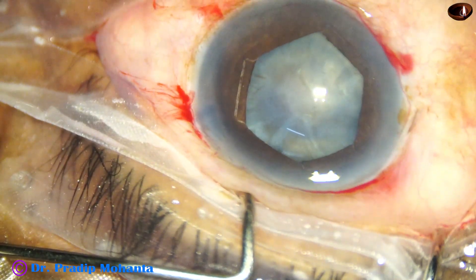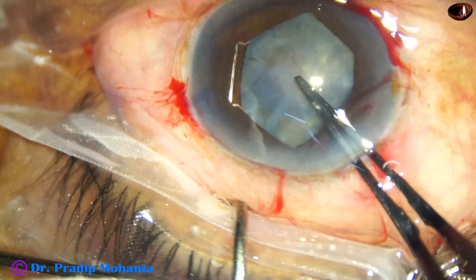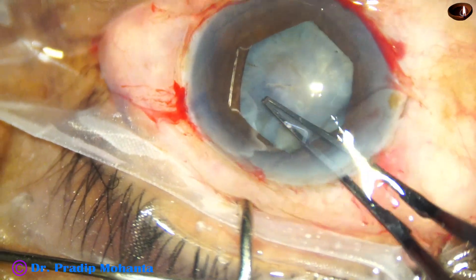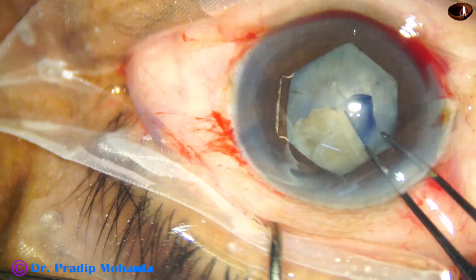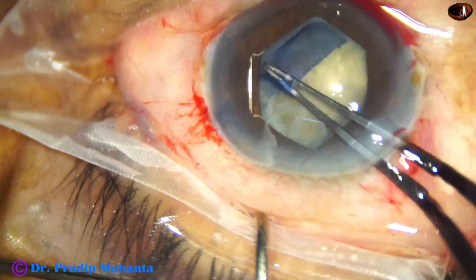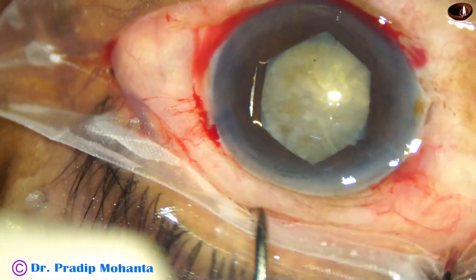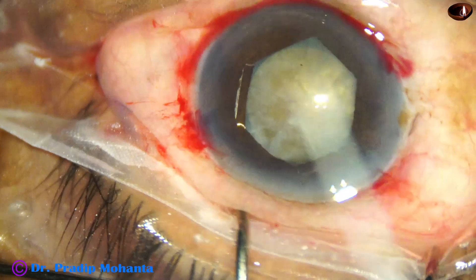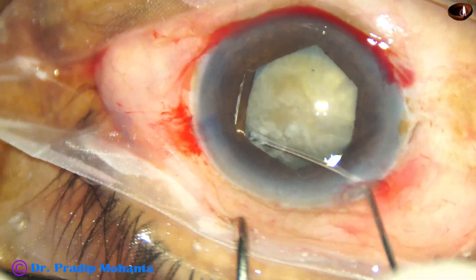The cataract is white but it is non-intumescent, and we can do the rhexis in one go without a mini-rhexis in such cases. The rhexis is about 5.25 millimeters; with B-Hex the pupil size is about 5.5 millimeters.